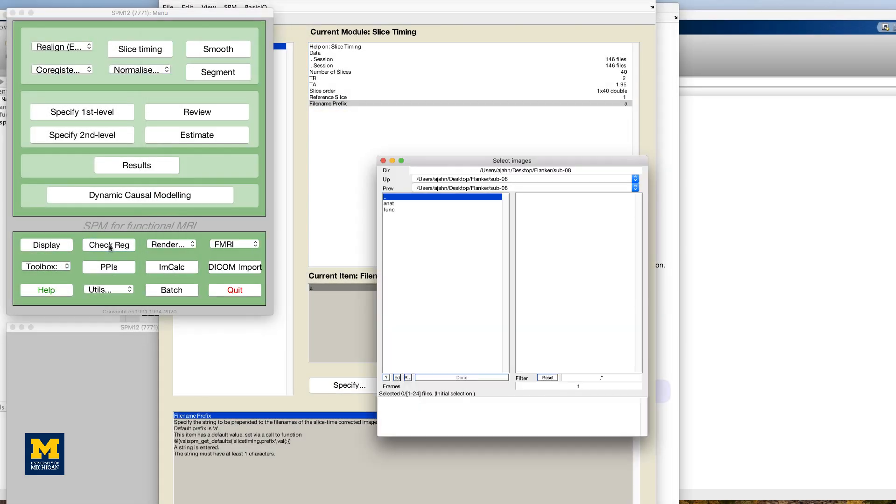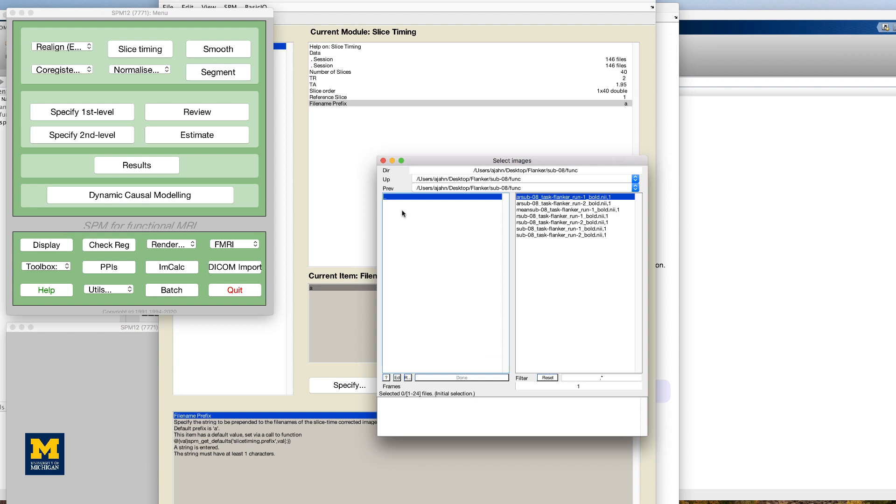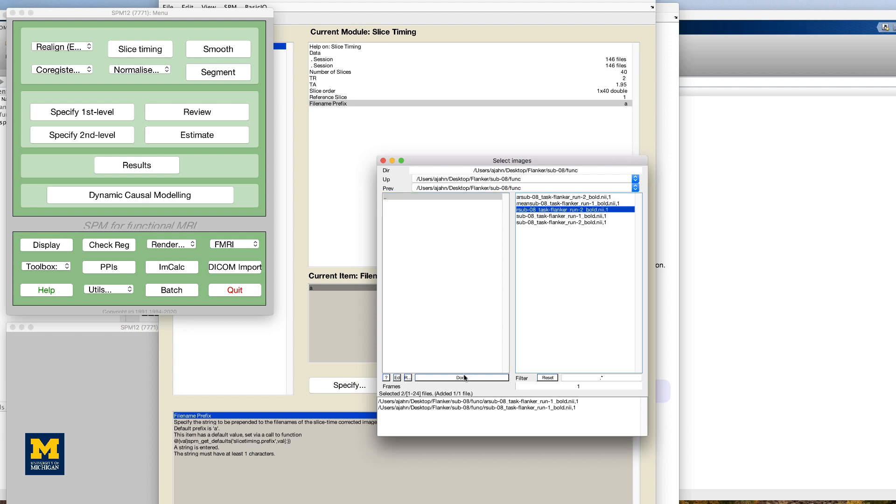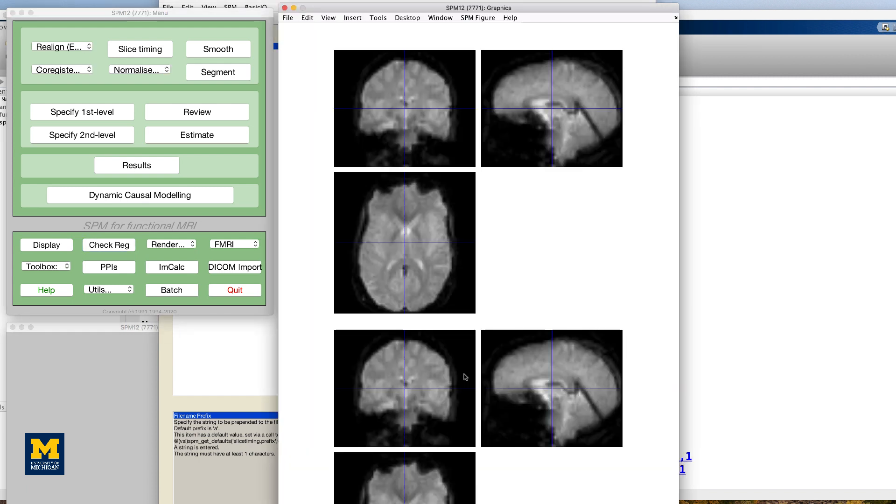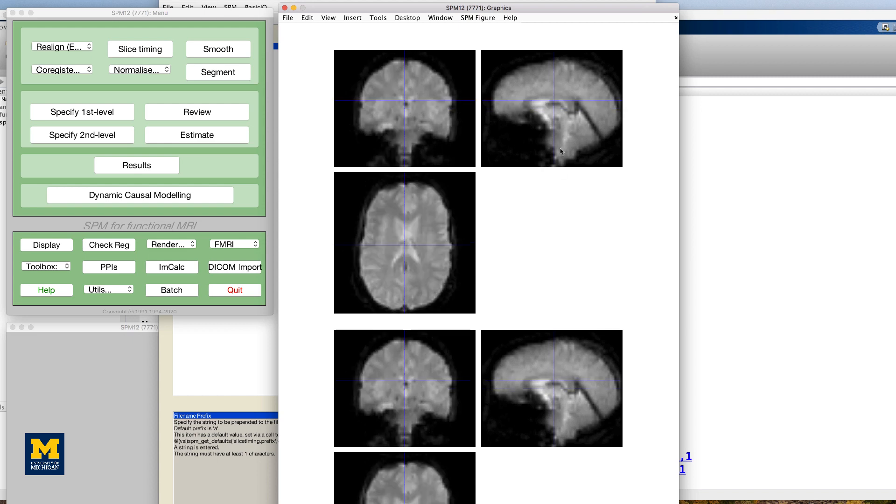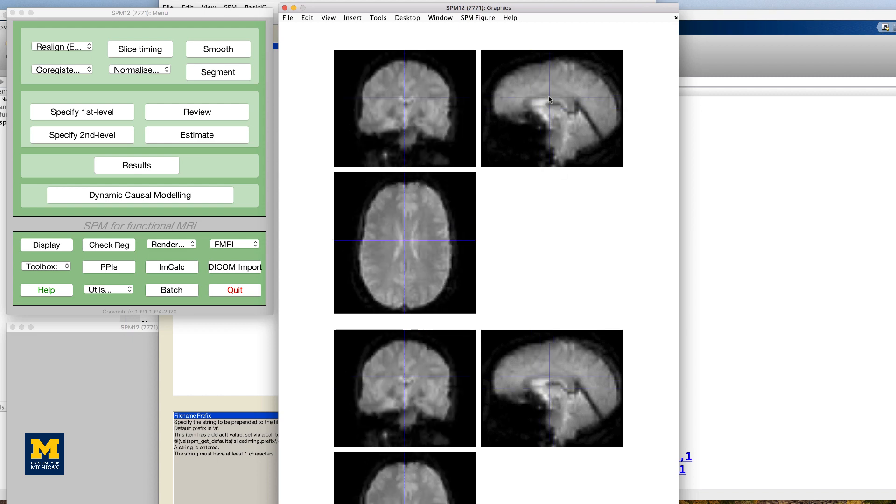As with the realign data, it is difficult to see any difference with the check reg button, but we will be able to better examine the differences between the input and the output in the other preprocessing steps.